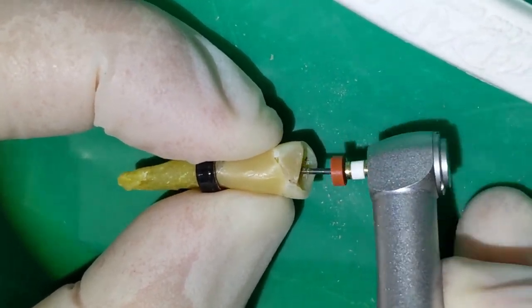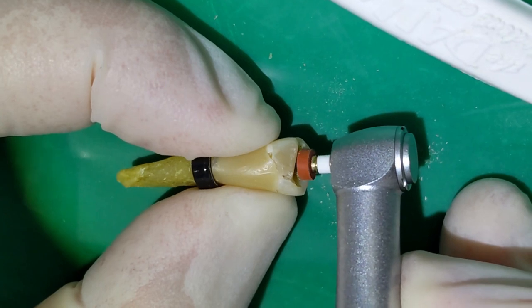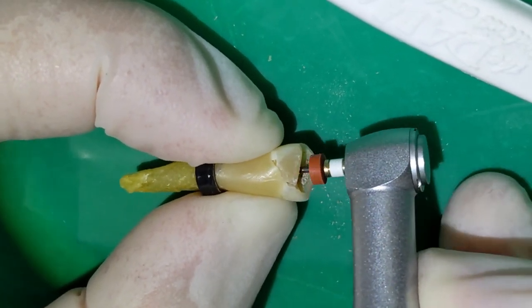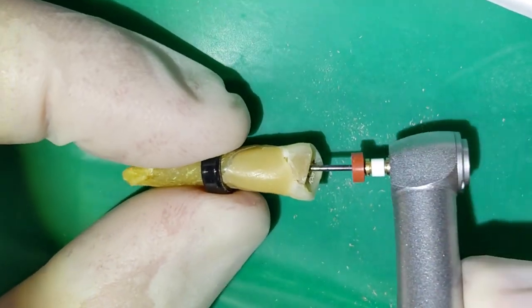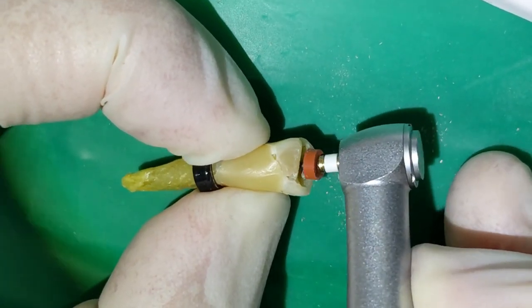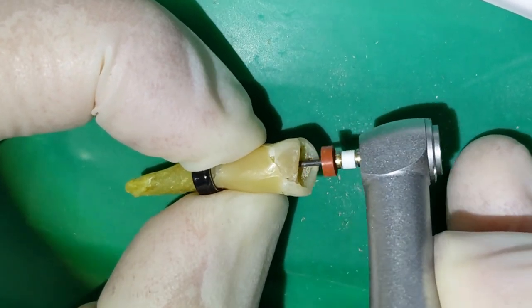So you keep cleaning. A lot of times you need to clean the top part of the tooth just to get down to the root tip. There we go. Clean off the flutes of the file. In addition to the sodium hypochlorite, we'll also use some lubricants too to make this whole process easier. I'm not using them for this video just because it makes it easier.